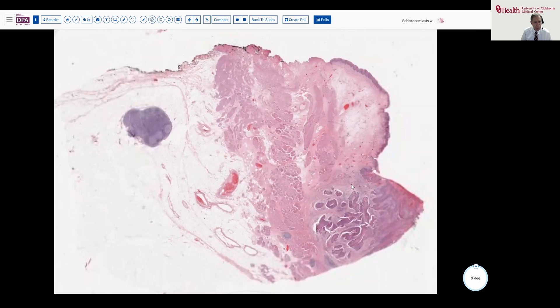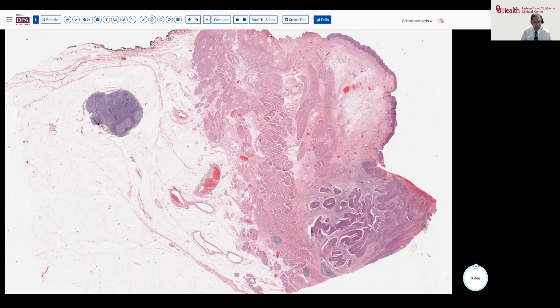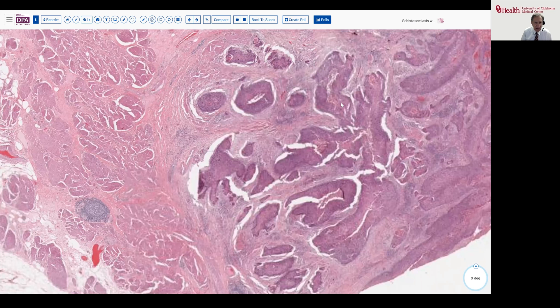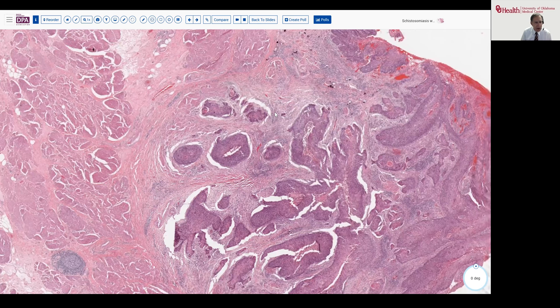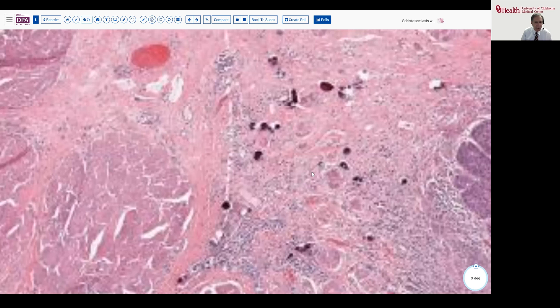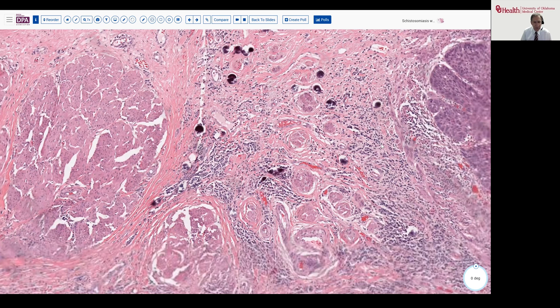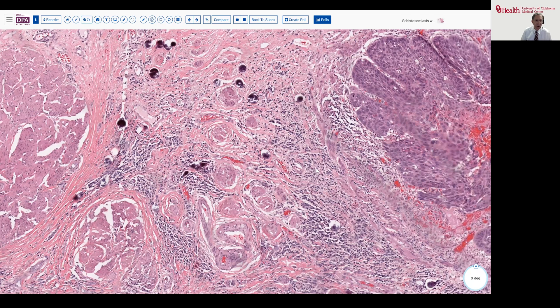I thought it worthwhile to include this example of a bladder cancer presenting in a patient with a history of schistosomiasis. You may not see the actual organisms per se, but looking over here we do see these longstanding, very calcified, and essentially dead schistosomal organisms. The association is not direct as a carcinogen perhaps, but may be related to the inflammatory response producing pro-inflammatory superoxides or dismutases that can then lead to epithelial chromosomal damage and the development of malignancy.